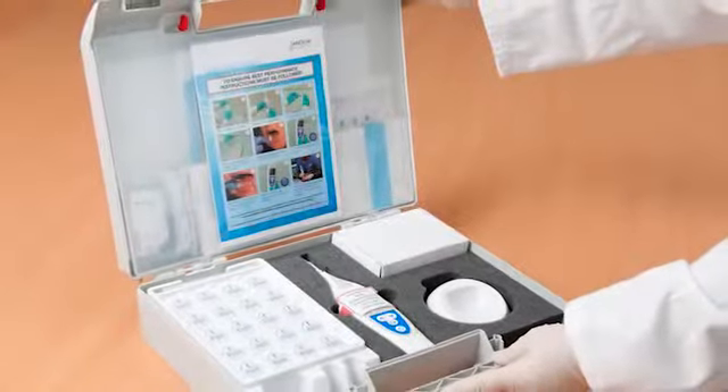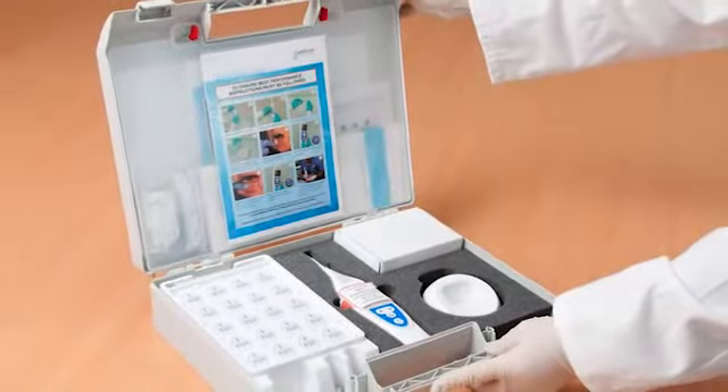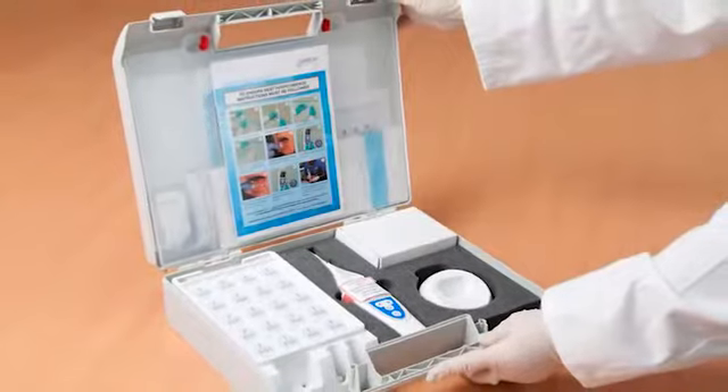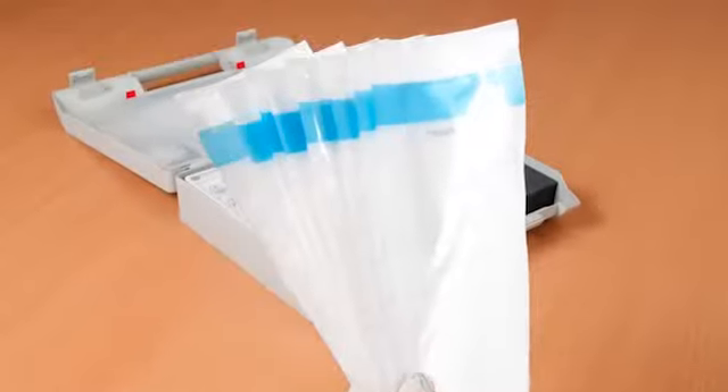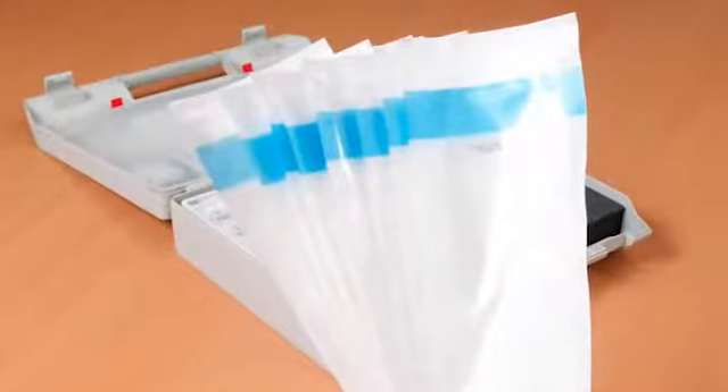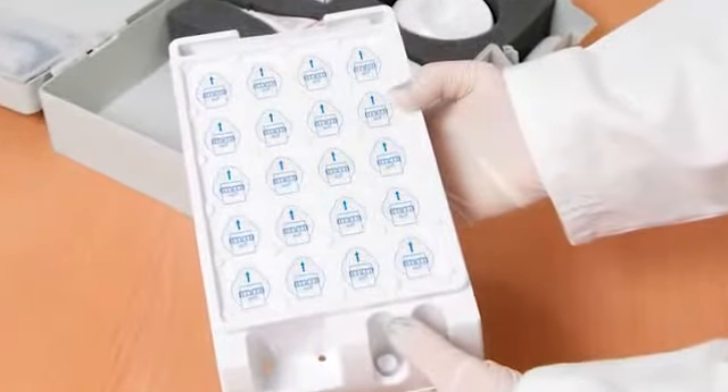First, open the box and check to make sure you have everything you need. Here's what's in the box: a printed user guide, 20 protective sleeves, and the tray of 20 sensors.